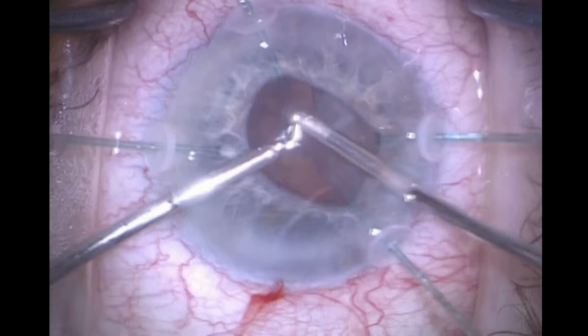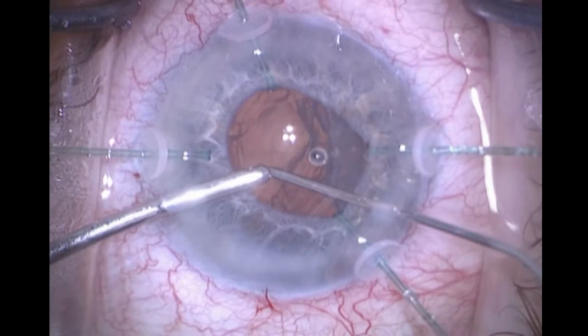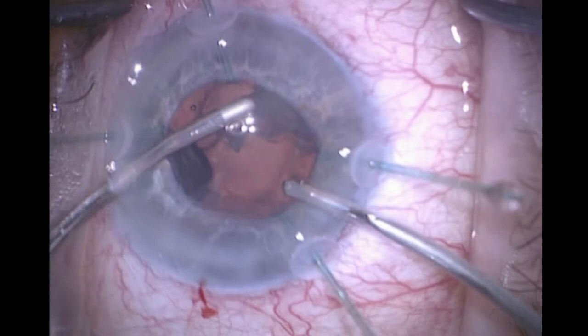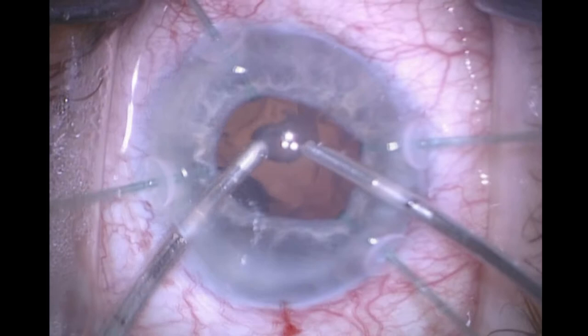I'm using bimanual I/A to help keep that port facing away from the posterior capsule, but it really helps to put in a dispersive OVD to basically put the posterior capsule on stretch — doing it by filling the capsular bag rather than having the zonules stretching it out. This allows me to separate the cortex from the capsular bag.